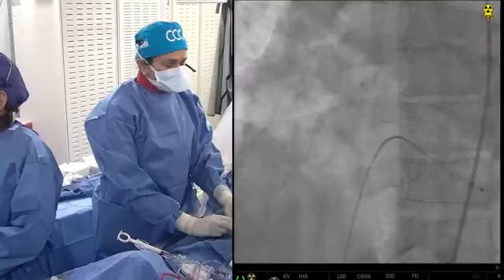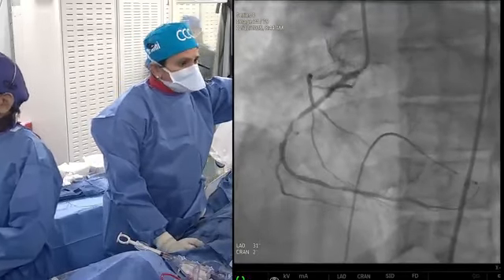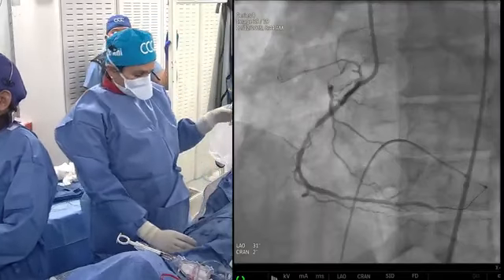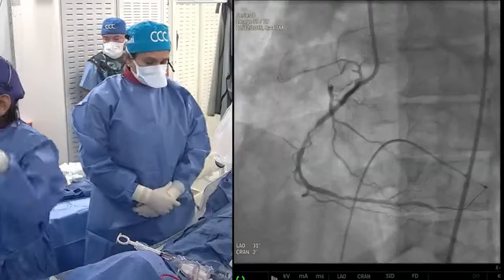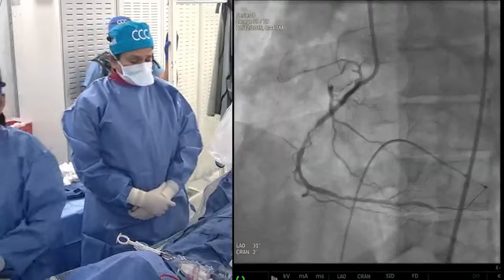What was the latest figure? But growing, OCT is growing. OCT used to be 5% about 2 years ago. Now so many OCT trials have really made it positive, going up. Now with the new design, particularly with the saline features, hopefully this number will go up.